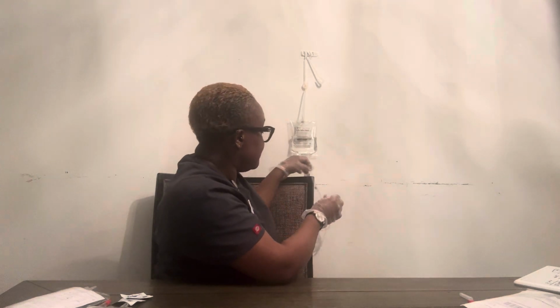Okay, so I have counted for 1 full minute to ensure that my drop rate is accurate, and it was actually 38 drops for that 1 full minute. In the real world, I would allow this infusion to continue running, but because I don't want to waste the medication due to limited supplies, I'm going to turn this off.